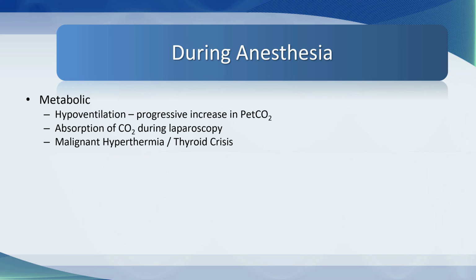start. Remember the picture from Nunn's respiratory physiology, whereby the CO2 takes quite a long time to build up in the blood. So you get this progressive increase in end-tidal CO2 purely because that minute ventilation that you gave Ralph at the beginning was just inadequate for him.